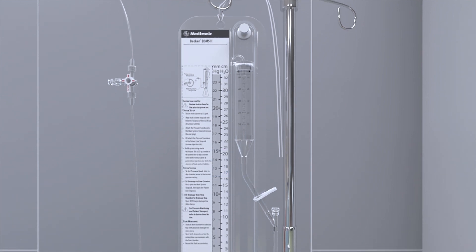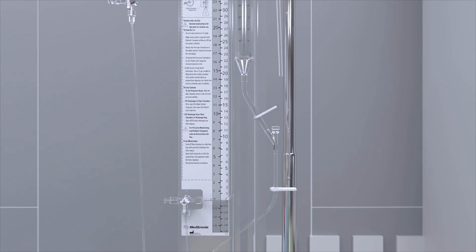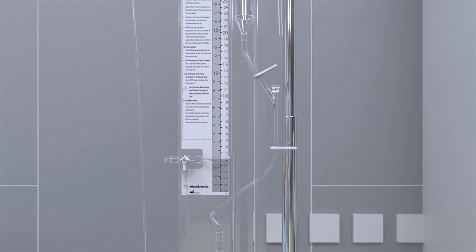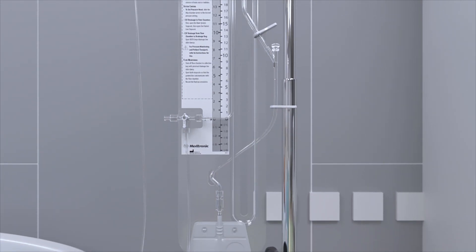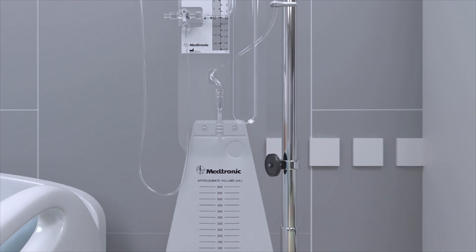The Becker External Drainage and Monitoring System from Medtronic provides the physician with a complete closed system for draining cerebrospinal fluid, CSF, while monitoring pressure and flow rate from the lateral ventricles of the brain or the lumbar subarachnoid space.